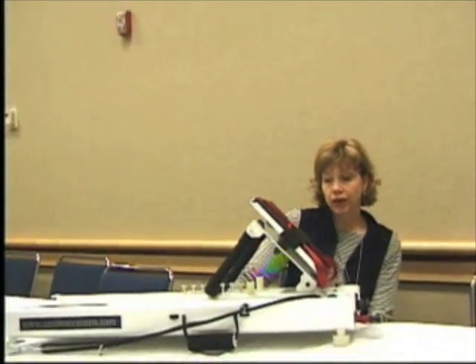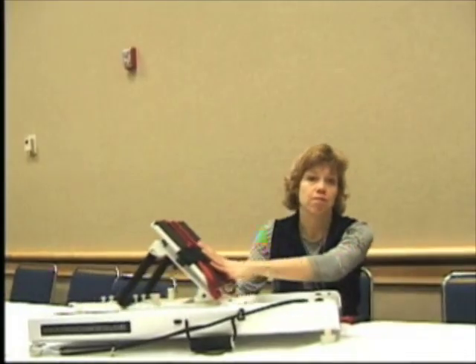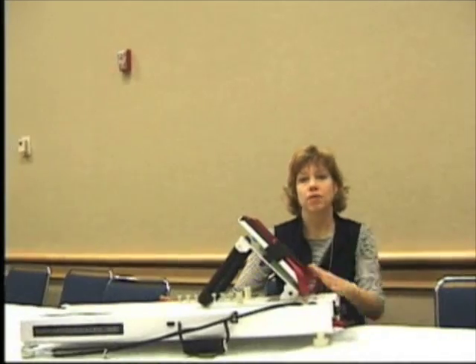We do high intensity strength training. One of the exercises that I think is really excellent — that I like the Mini Clinic for — is a hip and knee extension. The patient is supine, the foot goes on the footplate, and the person extends their hip and their knee. We start off at about 90 degrees of hip flexion and do a hip and knee extension.